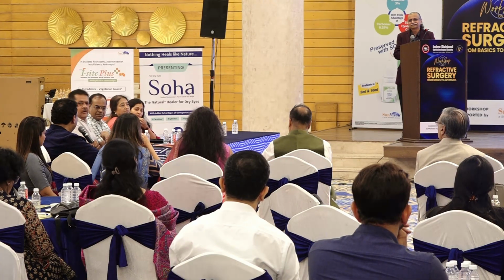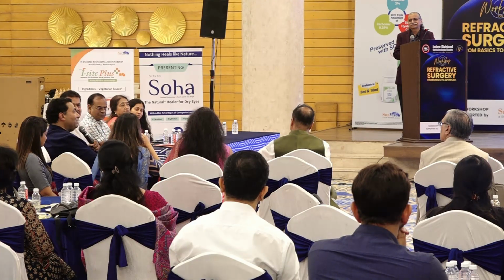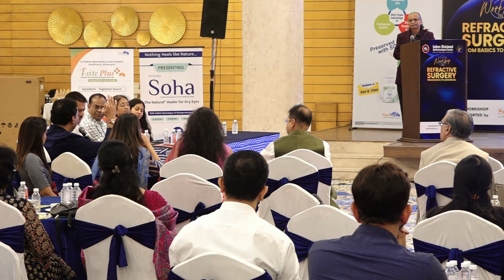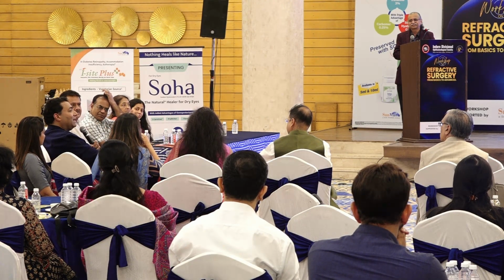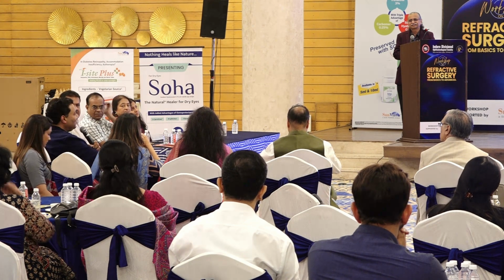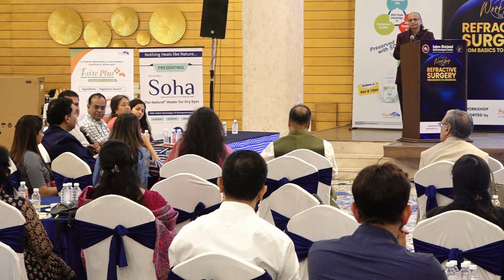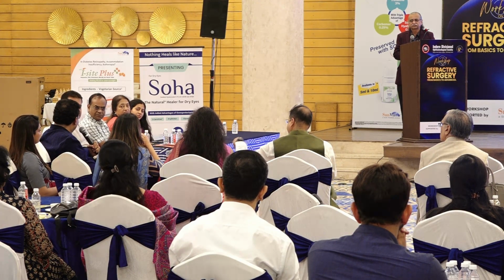Today, one of the challenges why you are not putting multifocal lenses is that 25 years back we were doing laser with a 3-4 millimeter zone with terribly bad spherical aberrations and terribly bad coma. Today, the same patient, if he gets cataract in 5 years, you can put the same multifocal as you would give a normal person.